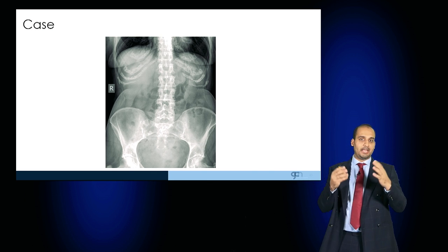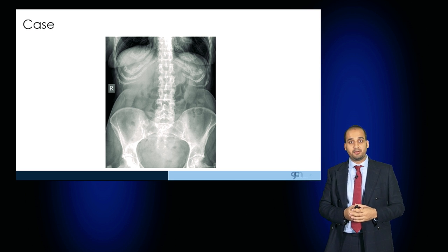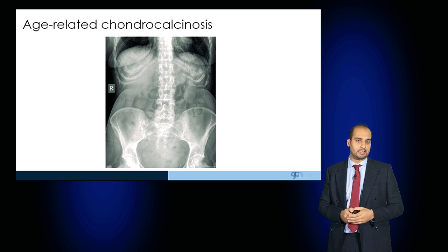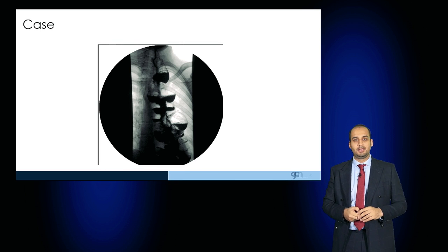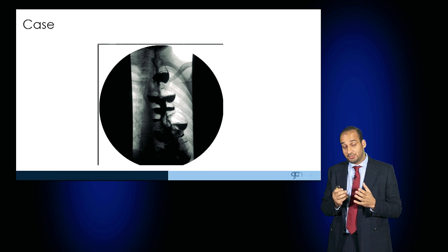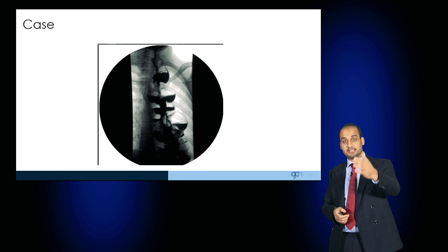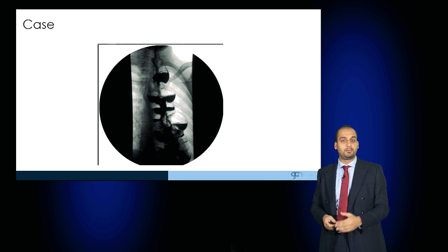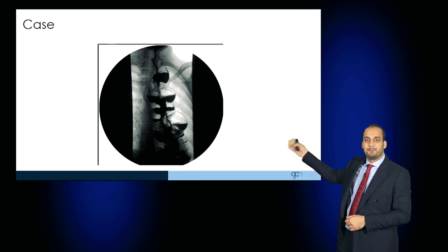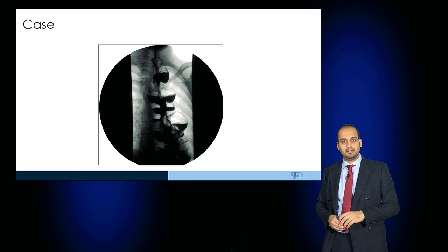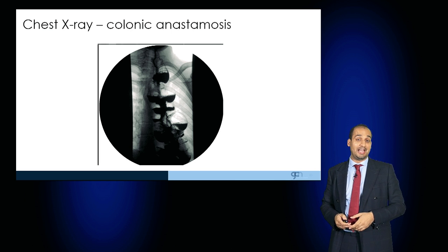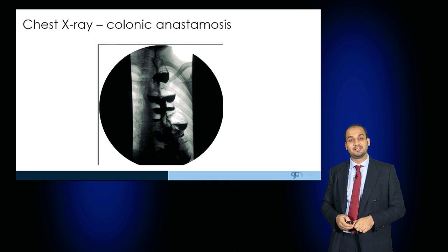This case is there for interest — you can see that the peripheries of the ribs look rather abnormal, but this is just age-related chondrocalcinosis. It's a normal finding in the elderly. This is an interesting image — this is the thoracic cavity as you can see the ribs, the left lung field and a small portion of the right lung field. But this middle connection, this oesophageal connection, looks like the colon — and actually this is a colonic anastomosis serving as a surrogate oesophagus.